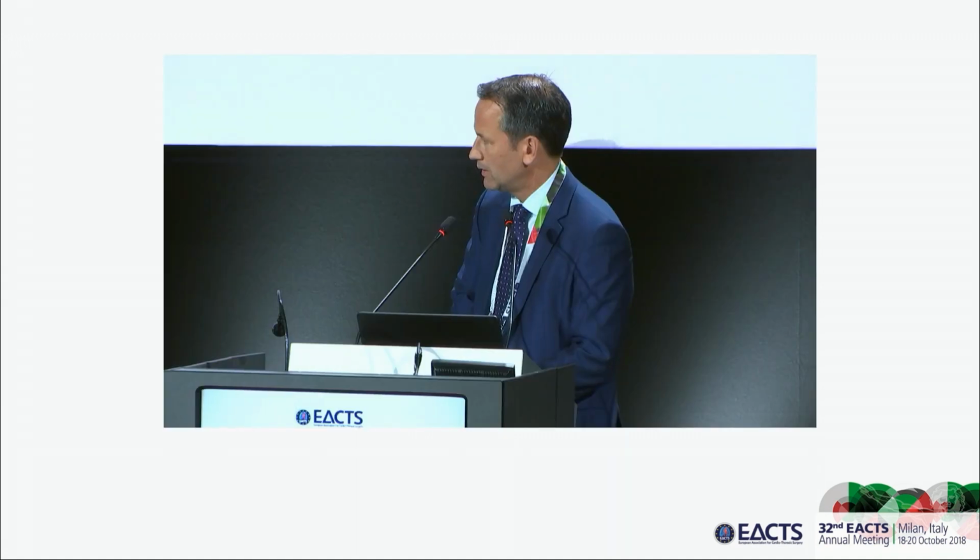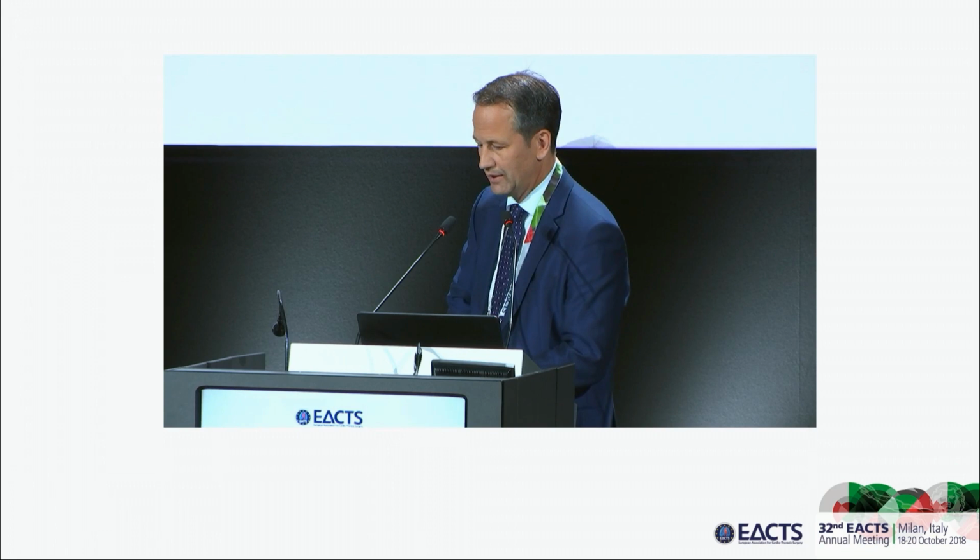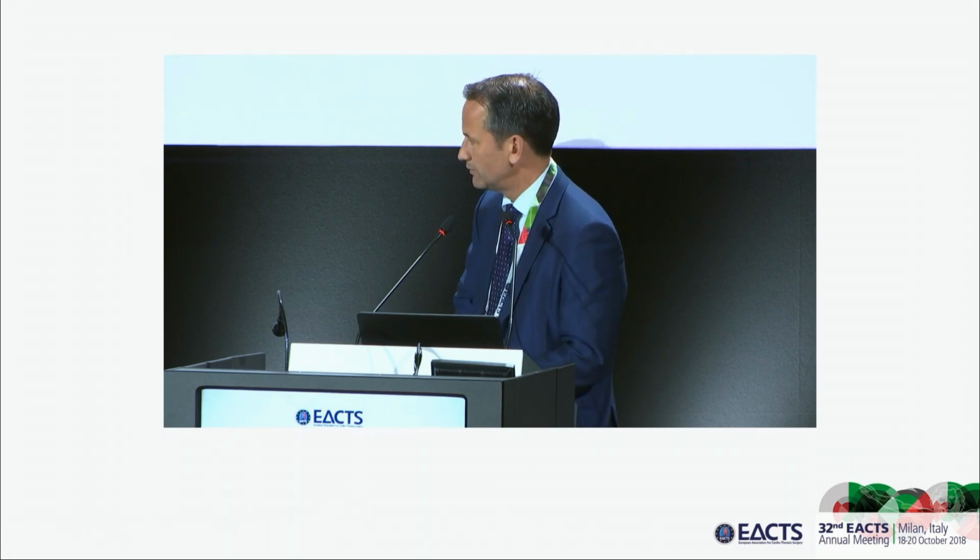To be honest, we've done over 6,000 TAVIs at our center. Even at our center, we don't really have any TAVIs post-valve sparing procedure, because they tend to be young patients. If they do come back, we will reoperate on them, and it's not that difficult just replacing the aortic valve. So I don't see that being a big issue. But it is technically possible. I know that. I've talked to people that have done it.